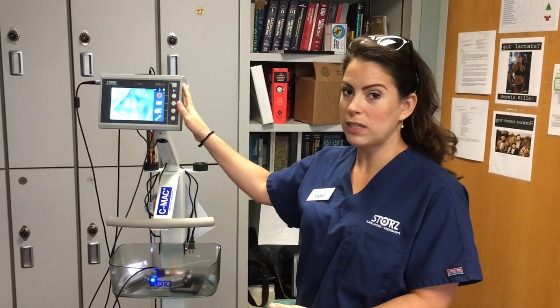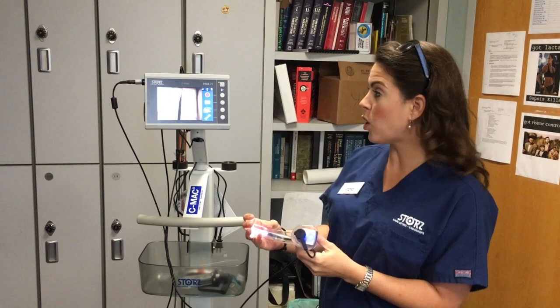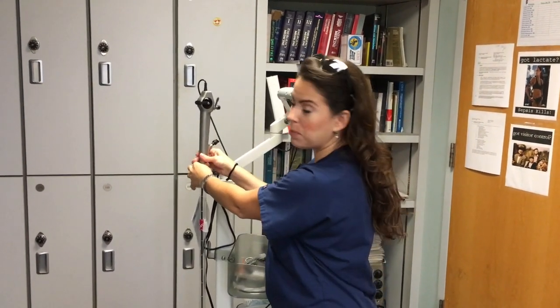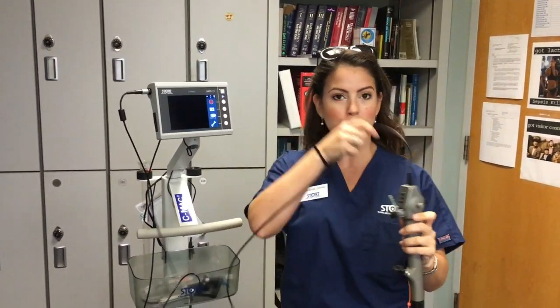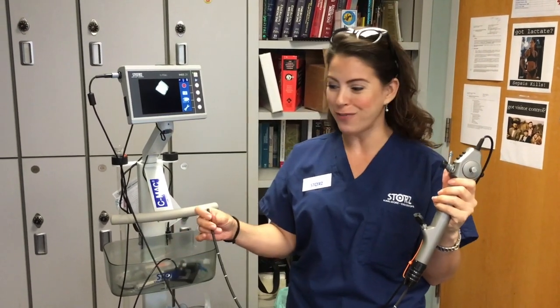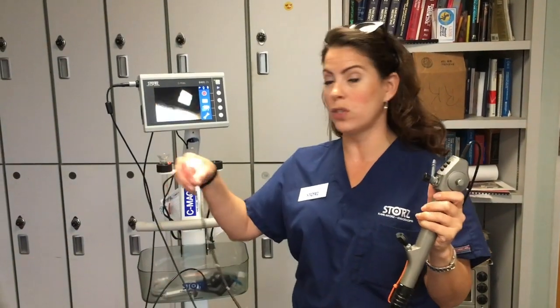To use the scope with the CMAC monitor, press the toggle button to switch between two devices. Right now we're on the blade; pressing the toggle switches you to the flexible scope view. Un-rubber band the scope — the rubber band holds it in place while moving the cart so it doesn't fly out. Make sure you control where the tip of the scope goes. We've removed all fibers from the sheath, so you'll never have broken fibers or black dots on screen. There's now a high-tech CMOS chip in the distal tip where your camera and light source are, so protect that tip.